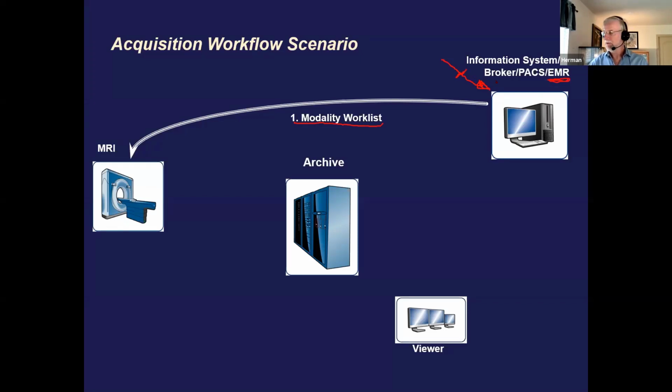The order will be mapped from HL7 into DICOM. And that needs to be done in a correct way, because otherwise you might be missing some information. We might be missing accession number, some of the obvious ones, or the procedure description, right? Or we might be missing out on filtering exactly the modality that we're looking for.